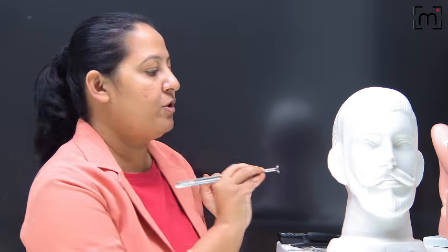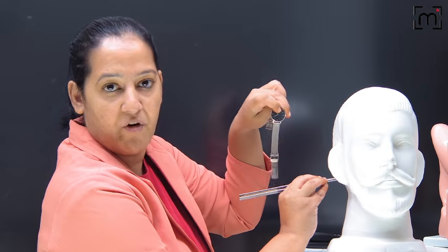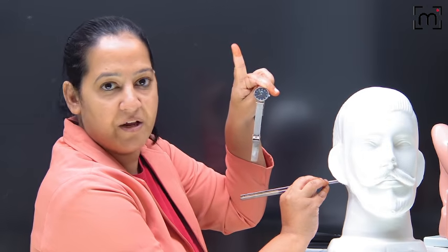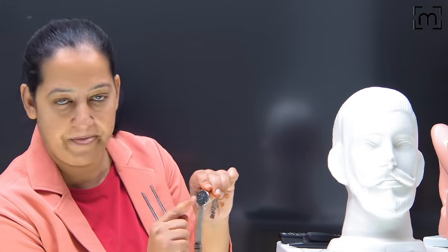So what I am doing, let's start with ABC. I am teaching you absolute bone conduction, the ABC test. I will activate the tuning fork, keep it on the mastoid of the patient and look for how many seconds the patient hears. I will start the stopwatch. As soon as the patient signals that they stopped hearing, I will stop the stopwatch and see the seconds, for 10 seconds, 15 seconds, 20 seconds, for how many seconds the patient was hearing.